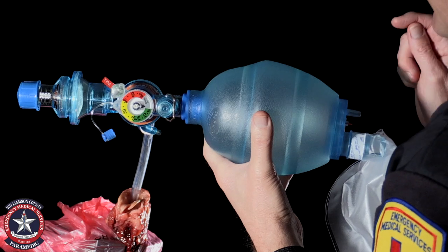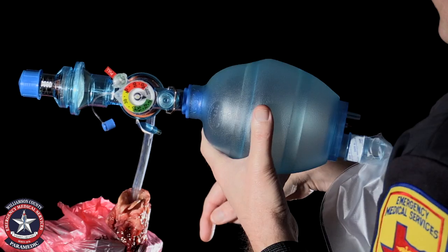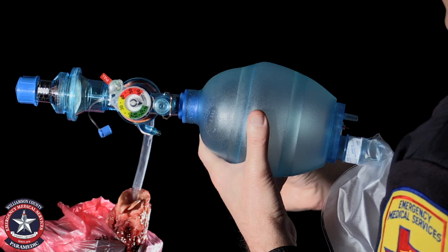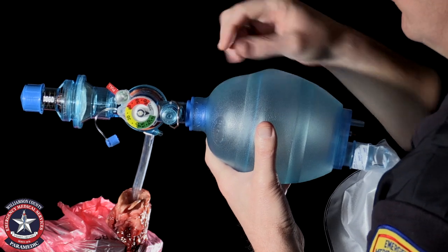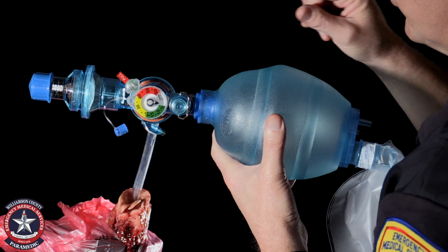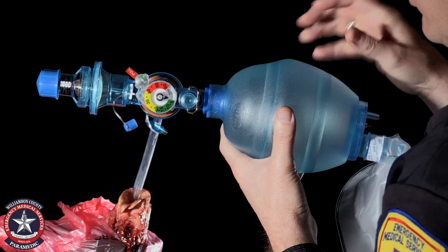The setup we have is a feral hog lung with an endotracheal tube going through the trachea with the cuff inflated, and we're holding on to the trachea. We're using a Mercury Medical Lifesaver BVM with a manometer and a PEEP valve. What we're trying to demonstrate here is the effect of PEEP on lung recruitment and maintaining lung expansion.